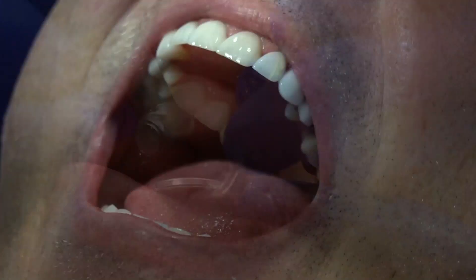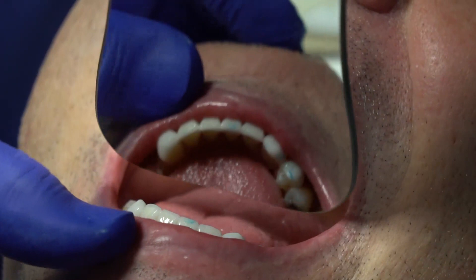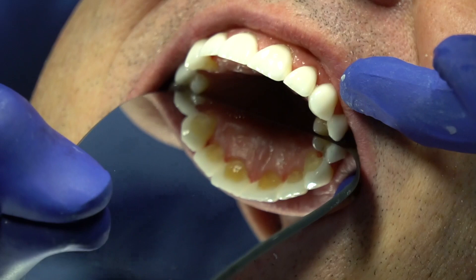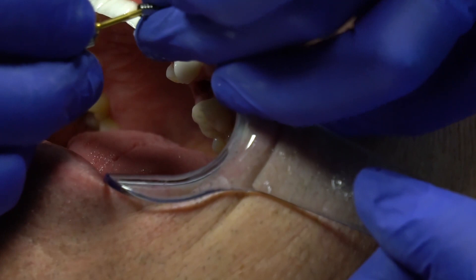There are the uppers — that's the implant over there with the healing cap. Then these are the lowers. He's still hitting just up from this area, so I want to touch that porcelain. You've all heard of a tie base — this is the healing cap. The tie base looks like this. It has a screw in it. What I need to do is make a tooth that goes in there, so I take a lab analog and screw it onto the tie base.